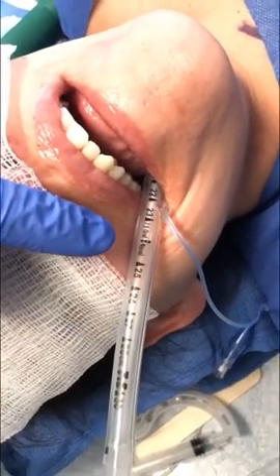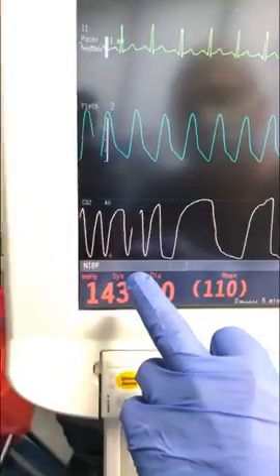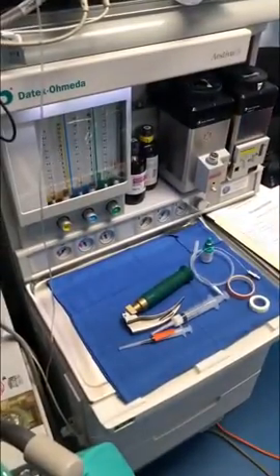All right, so I want to show you the condensation in the tube — that's our first clue that we're in. I've got symmetrical chest rise. Let's look up here — here's our end-tidal CO2, the only place in the body where CO2 is manufactured, and we got some. That means we're in the lungs. Boom, just like that. So that was the intubation just like that. Laryngoscope drop. Done.